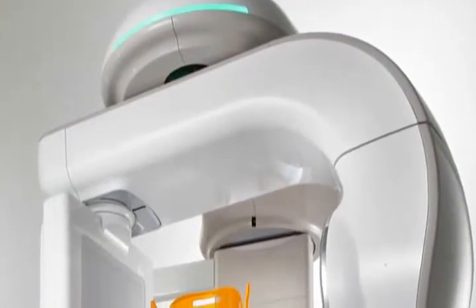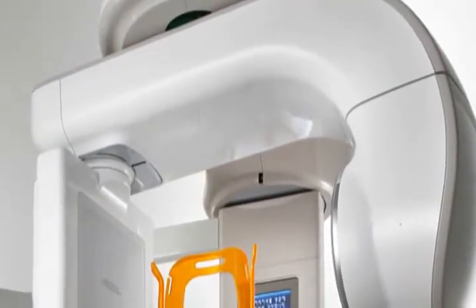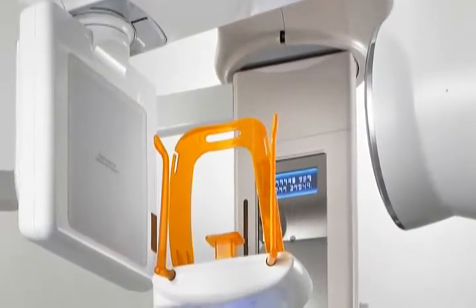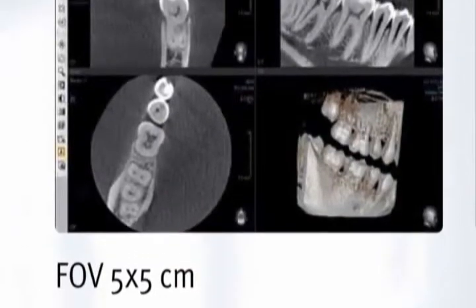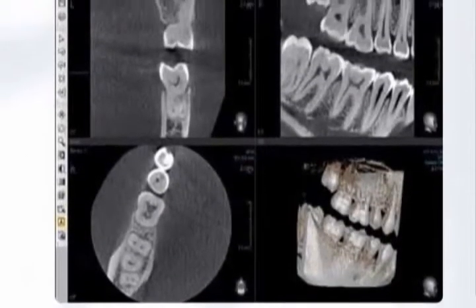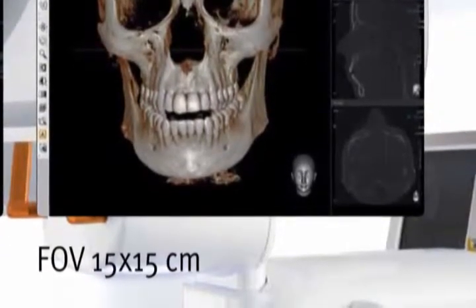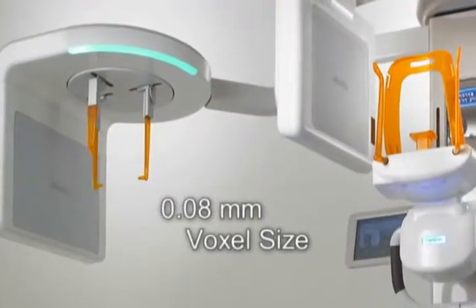With a built-in flat panel x-ray detector, the Pax Reve 3D incorporates the very latest cutting-edge technology. A flexible field of view ranging from 5x5 to 15x15 will limit the amount of radiation delivered to the patient while focusing on the area of treatment.